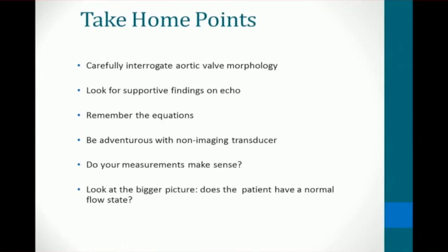Some take-home points on aortic stenosis are to carefully interrogate the aortic valve morphology and look for supporting evidence of aortic stenosis on echo. Remember the values and important equations used to determine aortic stenosis severity. Be adventurous with the non-imaging transducer to find the highest velocity across the aortic valve. Check to make sure your measurements make sense. If not, look at the bigger picture. What else is going on with the patient?